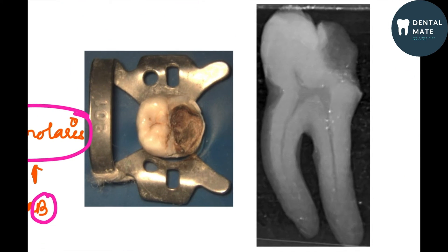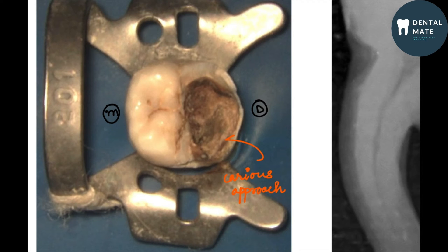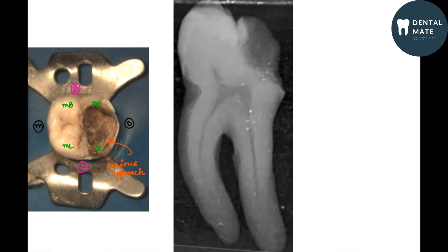This is the case we'll be performing the access opening on today. When we look at the clinical picture, we can see the mesial and distal sides. Since this is a large caries lesion, we'll be taking a caries approach for the access opening. We can identify the mesiobuccal, mesiolingual, distobuccal, and distolingual cusps.